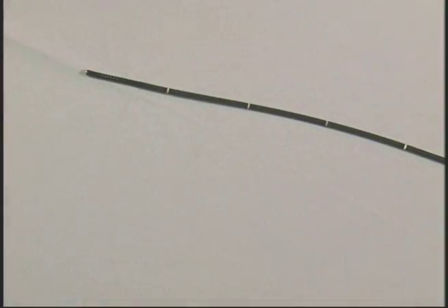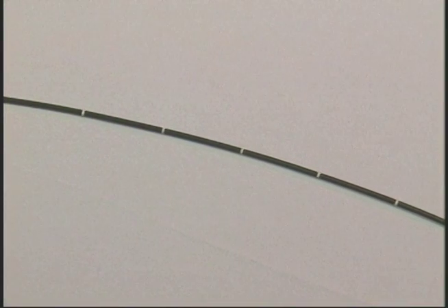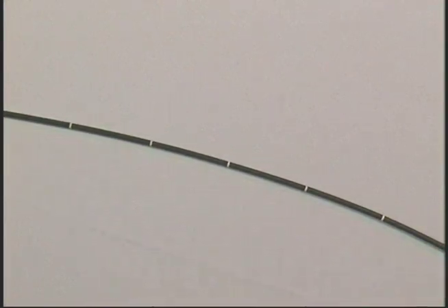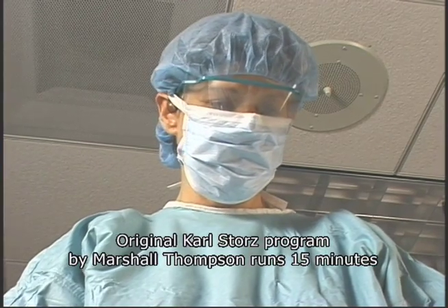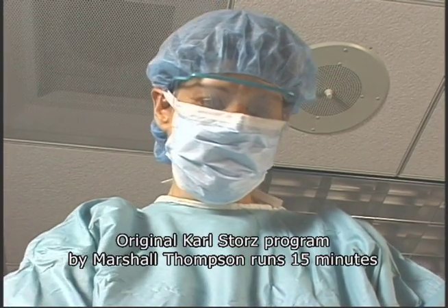Check the entire surface of the working shaft for any abnormal conditions or damage such as dents, cuts, wrinkles, or tears. Any indentation in the shaft of the endoscope can cause damage to its internal mechanisms.